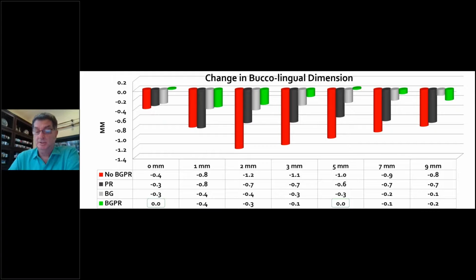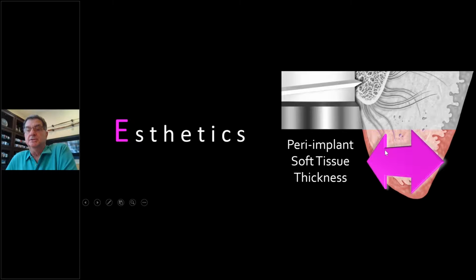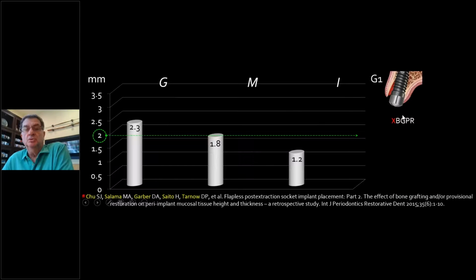So dual zone socket management is the way we've been doing this for about 8 or 9 years now. So the thickness of this gingiva right here, remember dual zone, we're grafting inside here. We did the thickness test: gingival third from the top of the implant, middle third, and the incisal third. Of course, the incisal third is always going to be narrow because it comes to a point. But I want the middle and particularly the gingival third to be as thick as possible, preferably, as you'll see, over 2 millimeters.